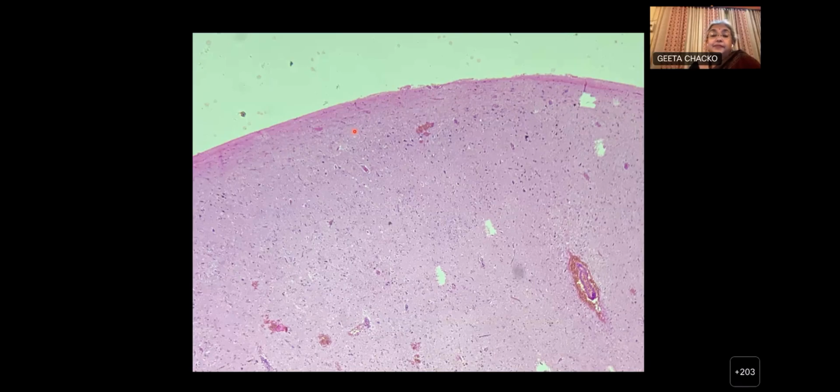Here we see an H&E stained section showing a diffusely infiltrating neoplasm of oligodendrocyte-like cells. At this power, what can you see? Moderate cellularity. Yeah, I would say very mild increase in cellularity. Okay, moderate would be much more. You're seeing more of this pink background, and it's actually the cerebral cortex with the tumor just going into it. So you're seeing just a mild increase in cellularity, but here it's moderate.